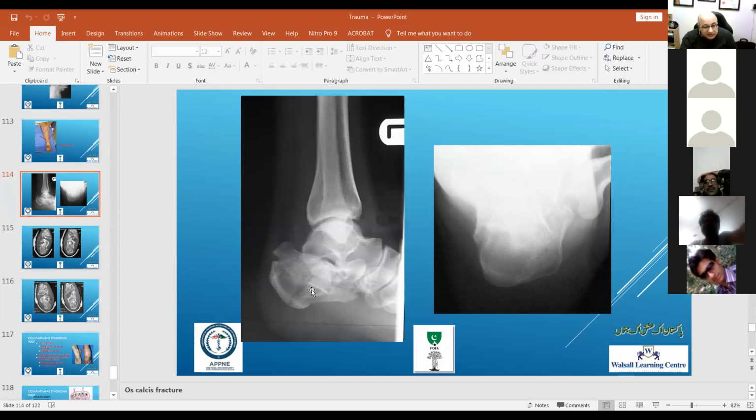So what lines do you need to know if you're talking about the calcaneum? Two angles: Bohler's angle and Gissane's angle. Very good. Do you know where these guys were from? Working in the Birmingham Accident Hospital, when I was doing my registrar rotation, the education center had both their pictures on the door.